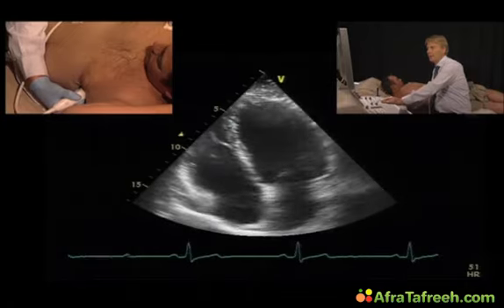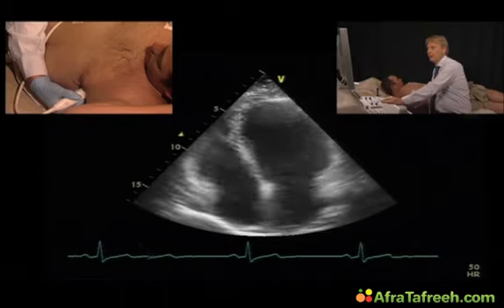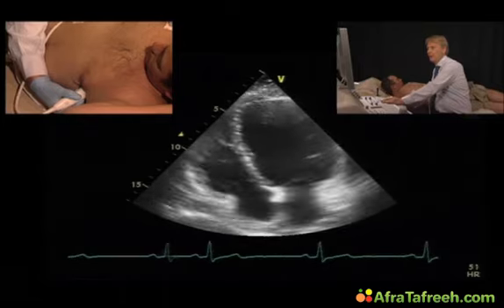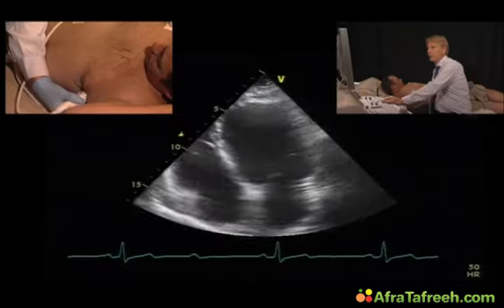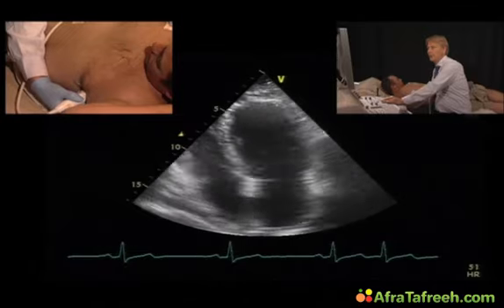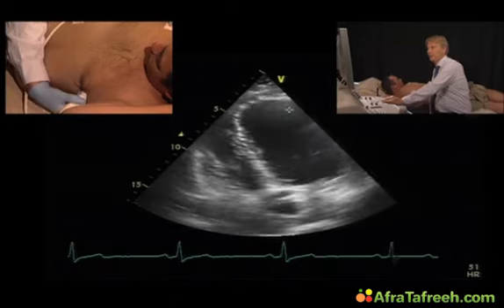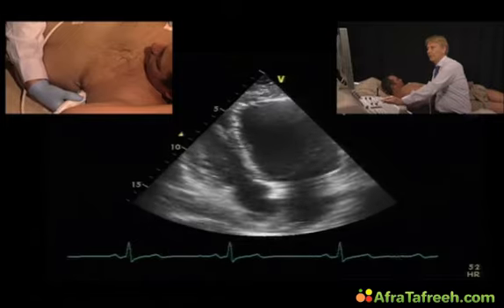This part of the septum still has normal wall thickness but seems to contract hypercontractile, while this portion here is scarred. There's a thin wall, and the scar reaches all the way to the distal lateral portion and shows some degree of dyskinetic motion.